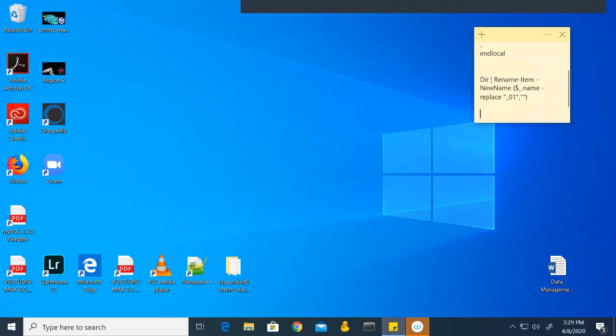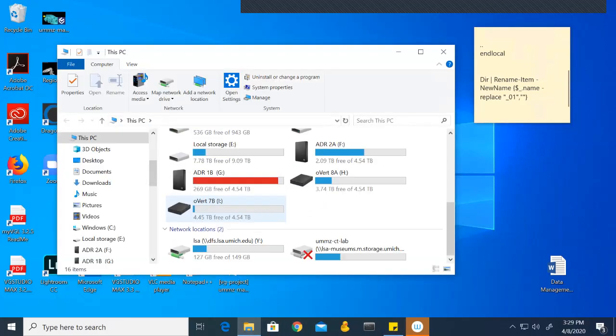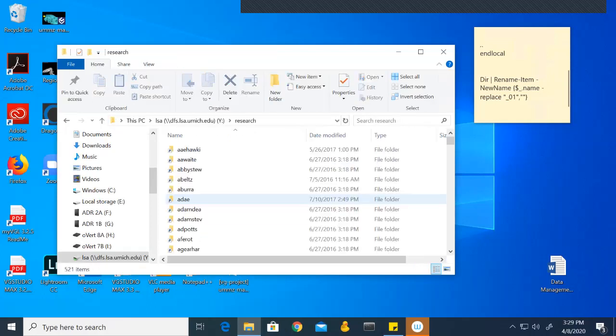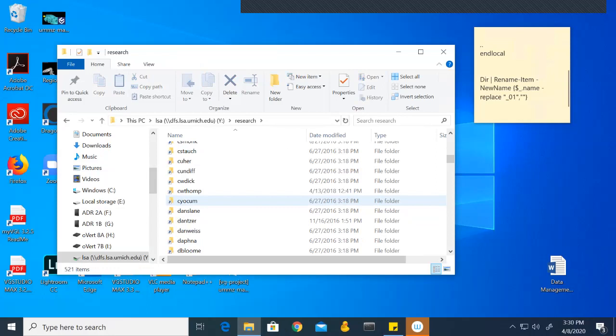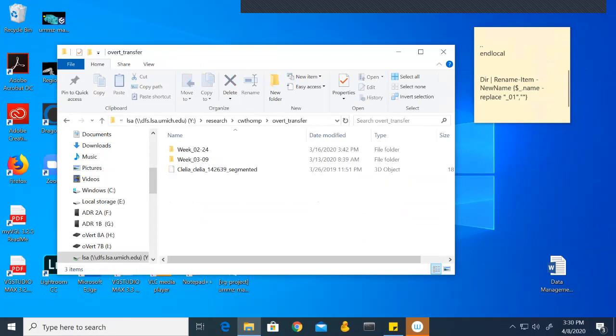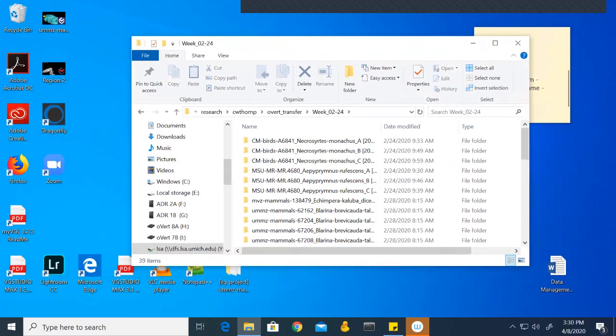First we need to copy the data from the research drive onto the hard drives. I go to file, the research drive, click on research, go to Cody Thompson's folder, and open overt transfer. As you can see, it's organized by the week. Each folder contains all the specimens that were scanned within that week.